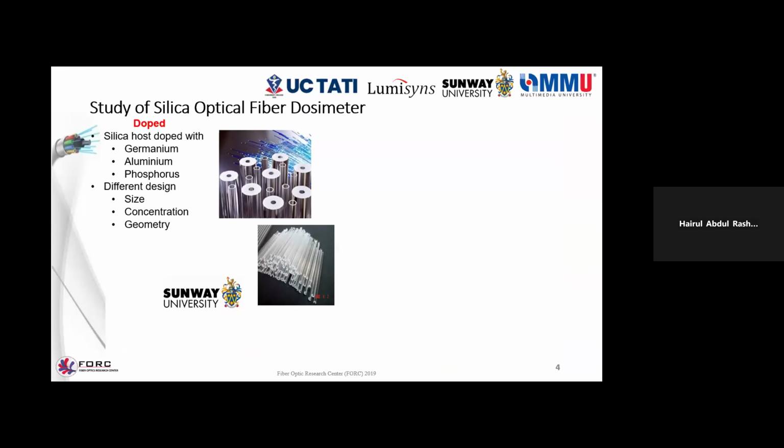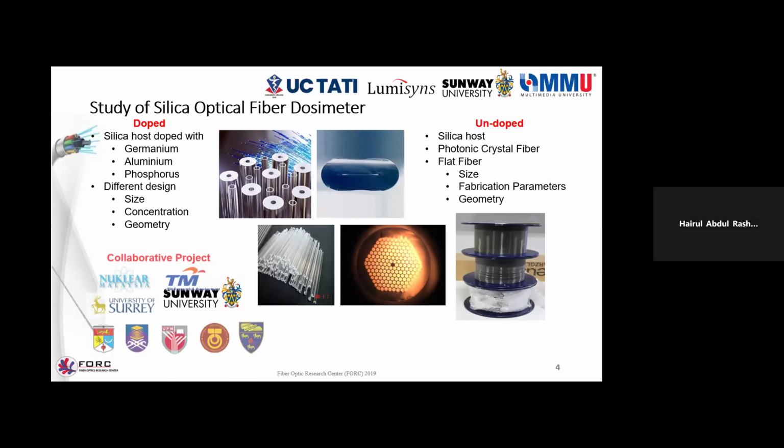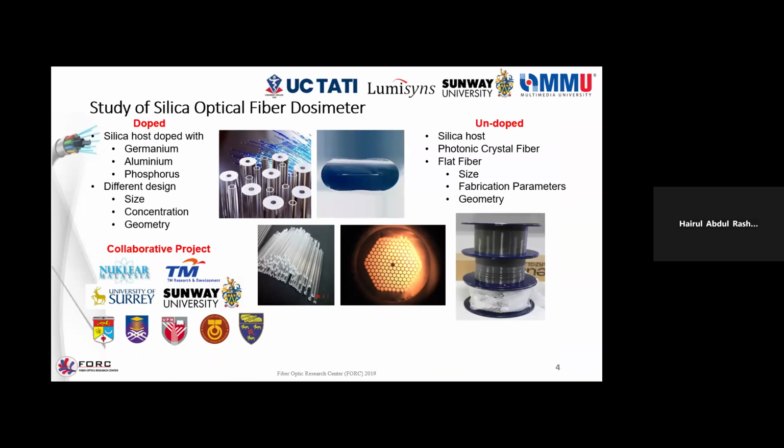We started off looking at silica optical fiber dosimeters, ones which were doped with different dopants. These are the typical dopants used in telecommunication applications. And we've also looked at undoped optical fibers. We have been doing this in collaboration with several strategic partners since 2015.